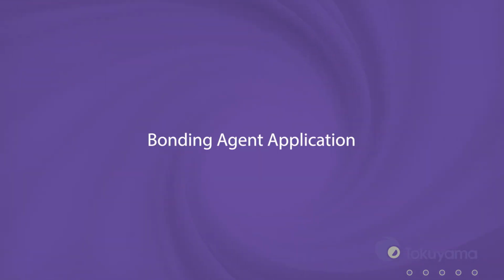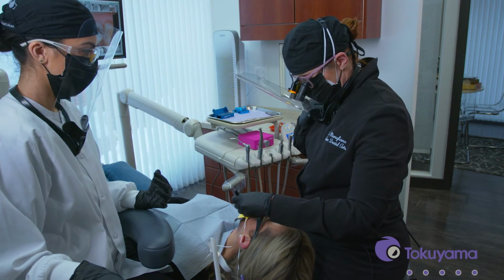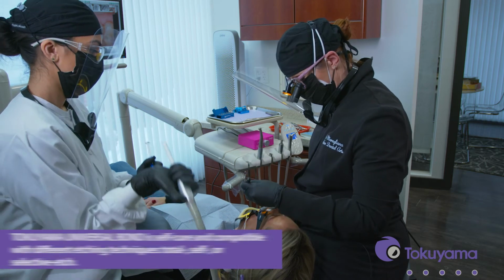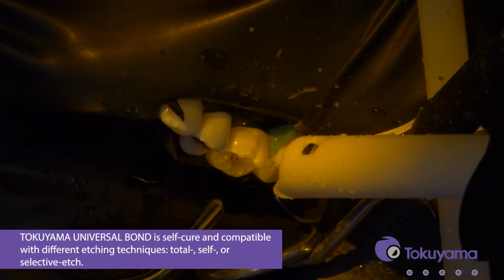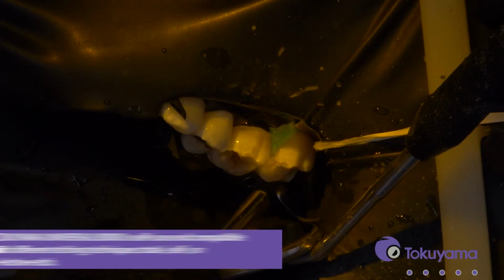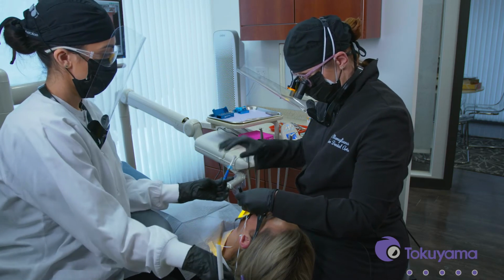To bond our restoration, we're going to use the selective etch technique. I tend to be a fan of that, but we're going to be using universal bond for this. Universal bond is awesome because you don't require a light, and it's also compatible with any etch technique that you prefer. So if you prefer total etch or self etch, you can use universal bond for that.